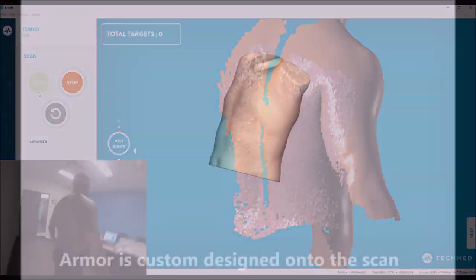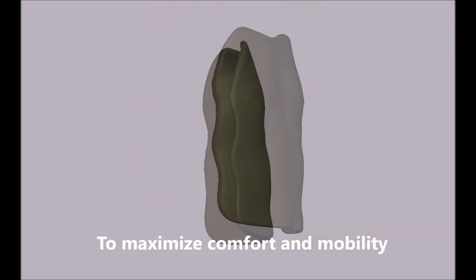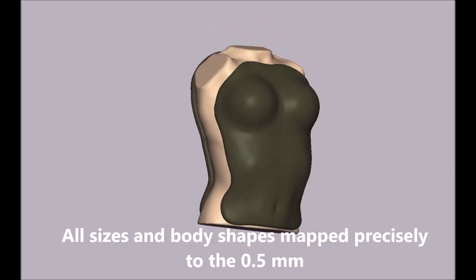ActiveArmor ended up creating the software that enabled the auto-generation of these types of casts. But then they have to be 3D printed, and that is more challenging. Production of parts is tough because you have to hit a tight timeline between when the patient gets scanned, the doctor orders a cast, and when they actually get the cast.